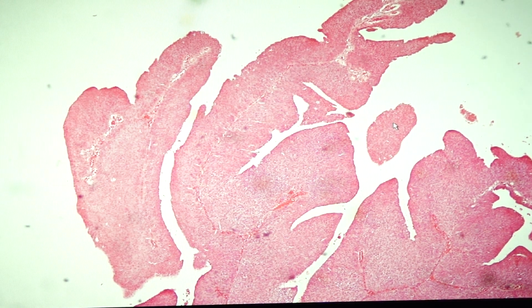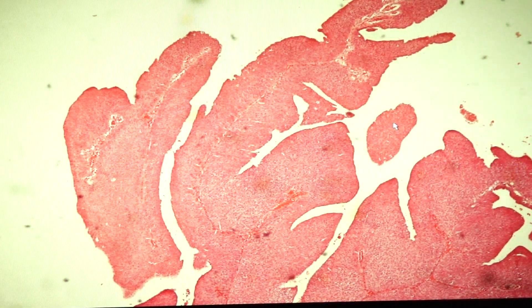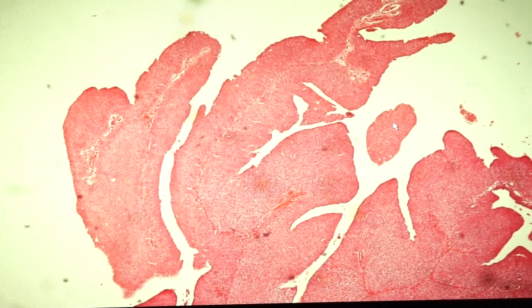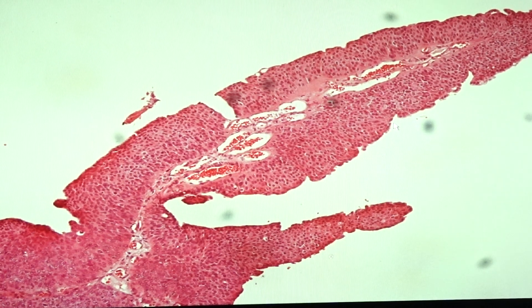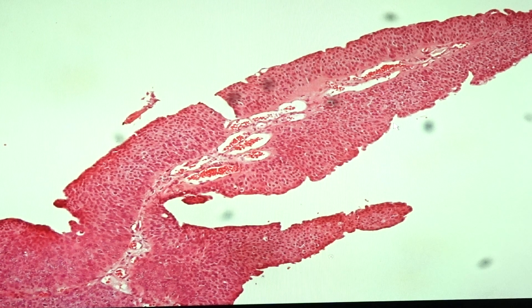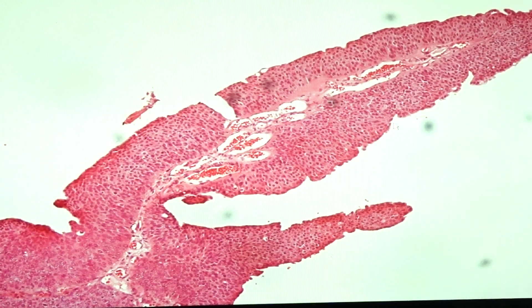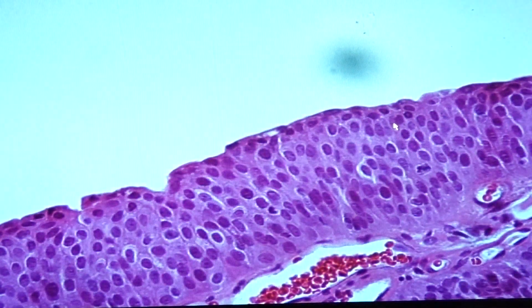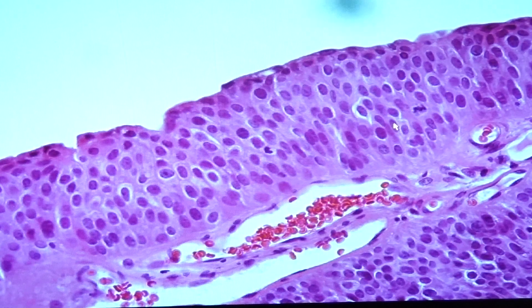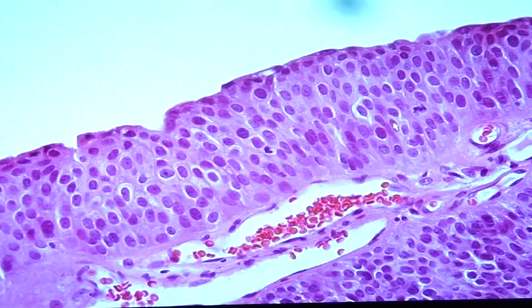Our first slide is slide 49. This is transitional cell carcinoma. If you remember in histology, the transitional cells are the ones that would line the urinary tract system consisting of portions of the kidney — that would be the area of the pelvis — and then we also have the areas of the ureter, as well as that of the urinary bladder. As you can see, this is a transitional cell lining, and in normal conditions we can see roughly around 5 to 7 layers of the transitional cells.